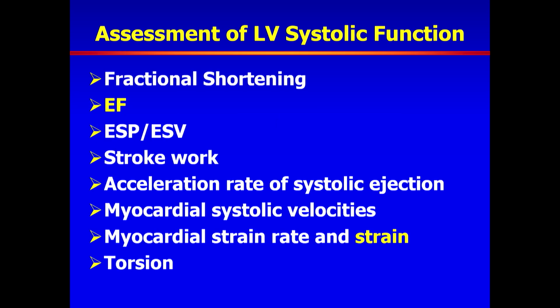So the point is, if the echo gives you a clear picture of the hypertrophy pattern, well and good. If not, CMR is your next option. If the patient is not a candidate for CMR, then CT, and the requesting provider needs to state, this is what I am looking for, so the lab is on the alert to get the proper images.